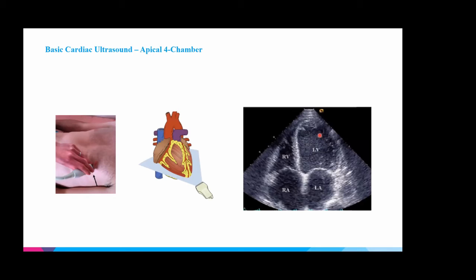And so in this view, keep in mind, by the way, I think the model's changed, that you should be wearing gloves for all of these, FYI. Yeah, this is just for your guys' purposes.